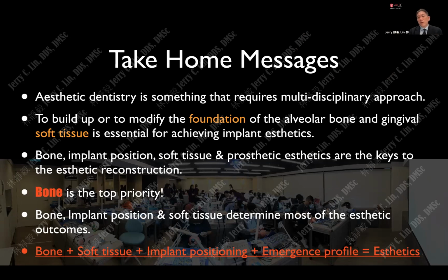So I would like to share with you my thoughts. Even though implant aesthetics is very difficult and very challenging most of the time, I would like to propose this approach and protocol, where we solve the bone issue, the implant position issue, the soft tissue problem, and the emergence profile. The prosthetic work is very important to get the very final result and aesthetics. So I would like to share this equation with you as a take-home message for all of you.